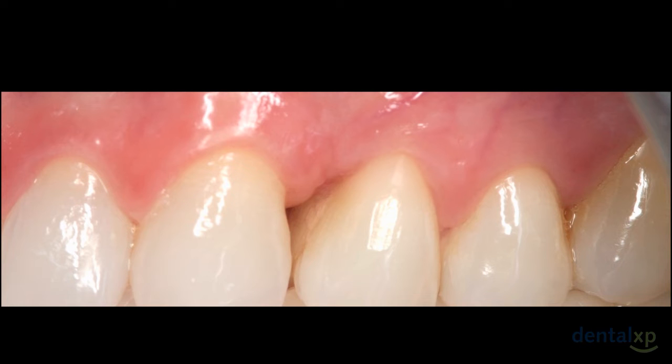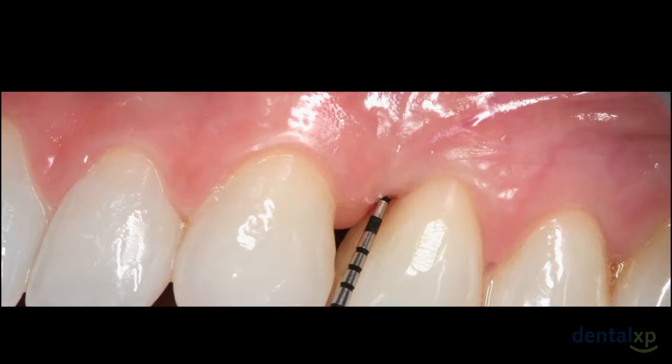The patient returned, and you can see a mild amount of calculus on the mesial, and this is approximately 3 months later. We're cosmetically able to keep a result that was within reason, because if you consider where the original bone loss was, we certainly could have ended up with a major issue. Upon probing, I was pleased to find only a 3 millimeter area, and also if you'll notice there is blanching of the tissue, so you know that we were probing significantly to find out how deep the defect or sulcus really was. There was absolutely no bleeding at the time of probing.